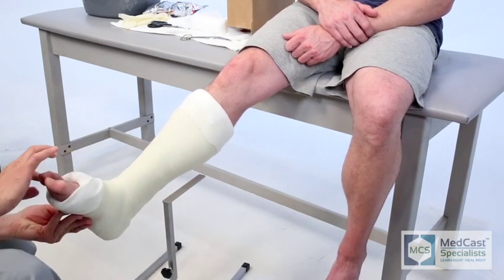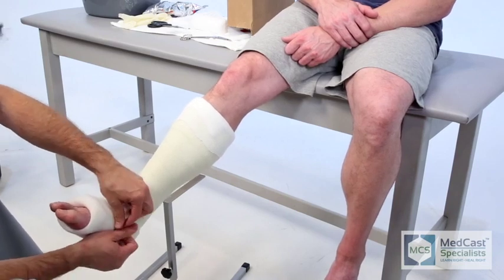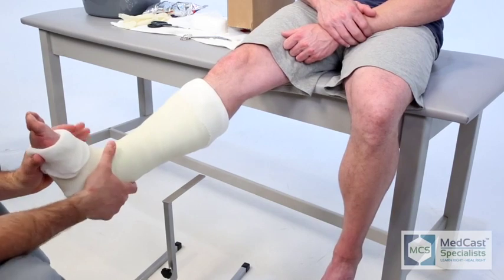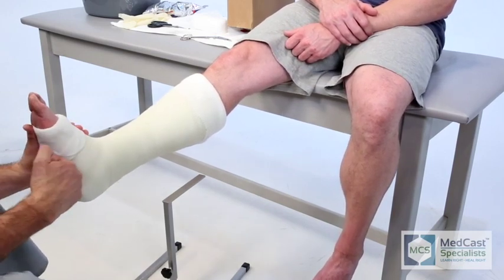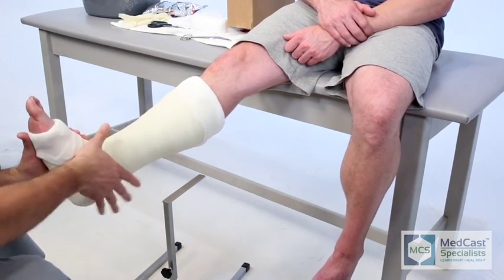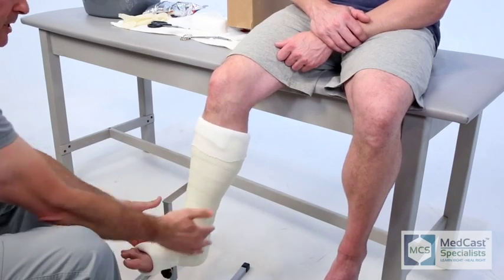Make sure that the fifth toe is not being impinged or pushed on by the lateral portion of the cast. If you're doing a non-weight-bearing cast, it's still very important to try to keep them at 90 degrees, because when they come back and you transition them into a walking cast, you don't have a tight Achilles tendon — and it's less work for you and less work for the patient.